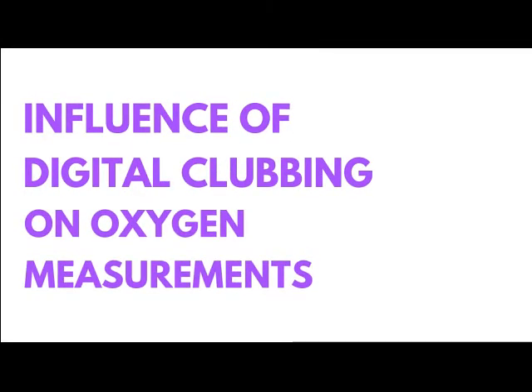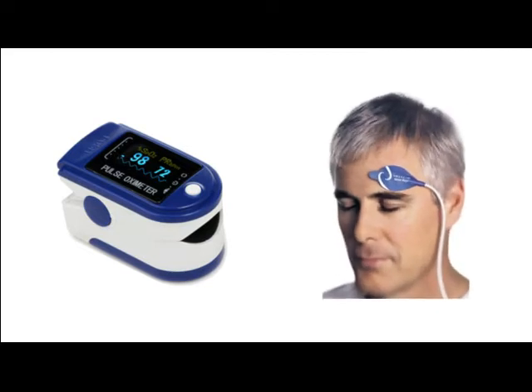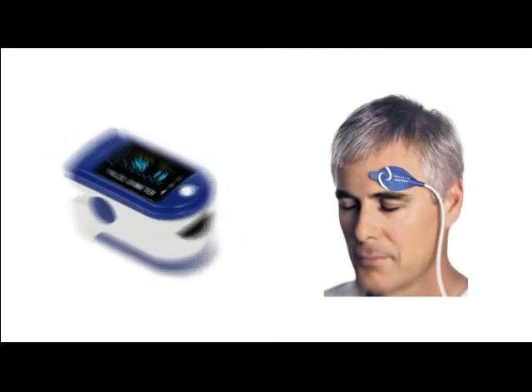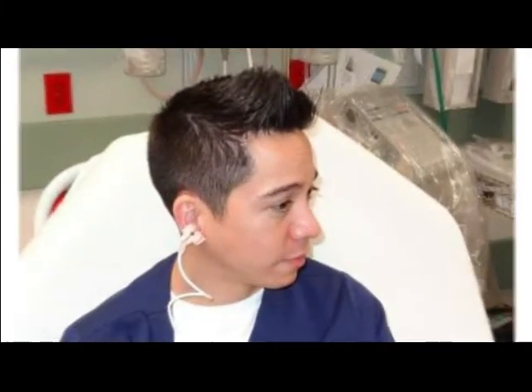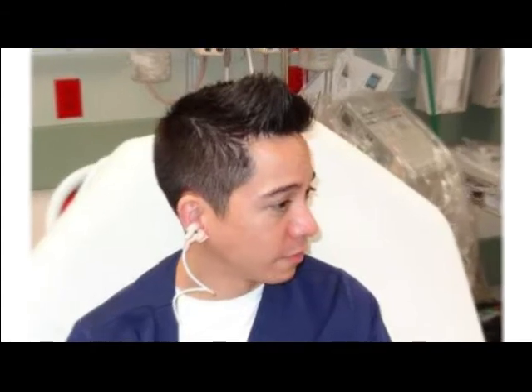The measurements are obtained using a fingertip sensor at the right index. Example of the transmission pulse oximetry and multi-site sensor at the forehead. Example of the reflectance pulse oximetry. Finally, an ear sensor at the right ear, transmission pulse oximetry, is applied to have a reference variable in comparison with the other two measurements.